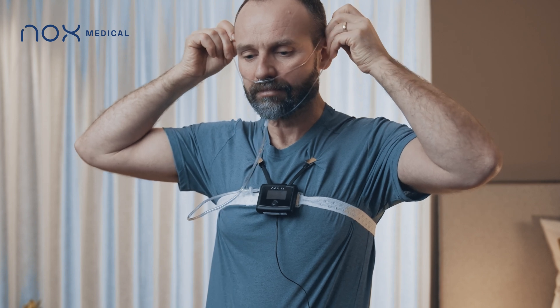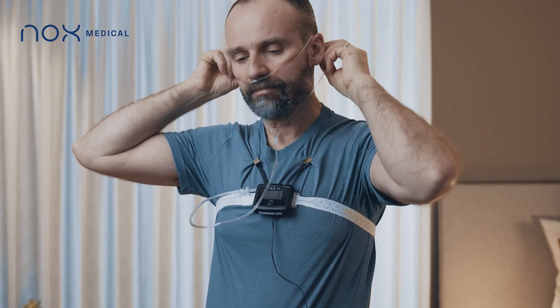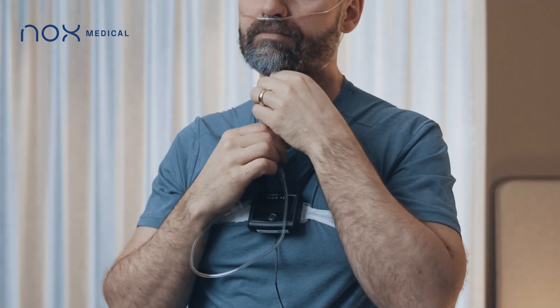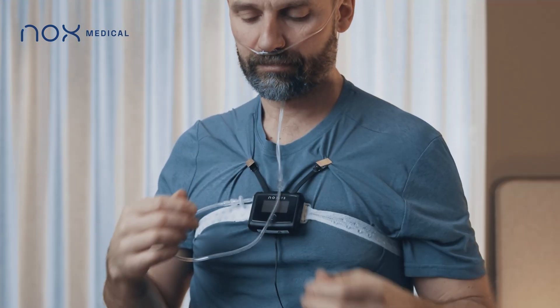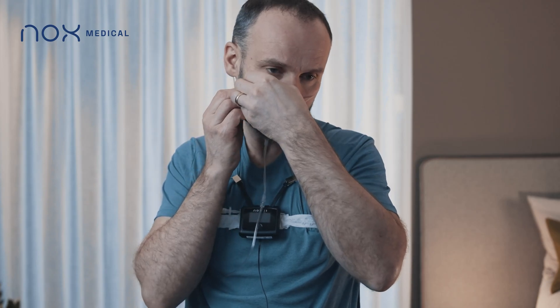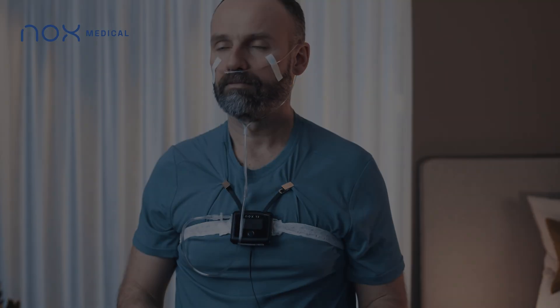Pull the cannula tubing over your ears, then position it under your chin. You can slide the fastener under the chin to hold the cannula tubing securely in place. You can also put a little piece of tape on the cannula on either cheek to hold it securely in place.